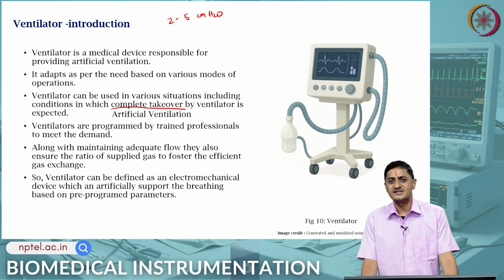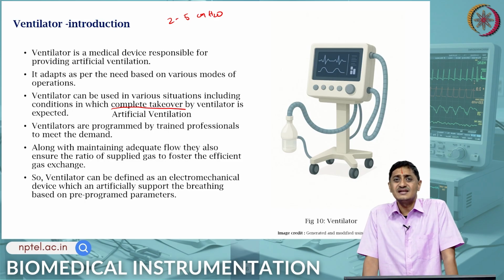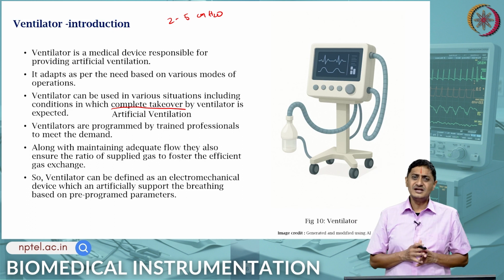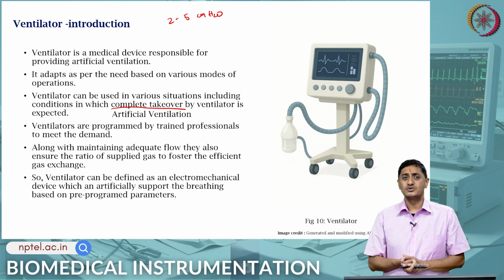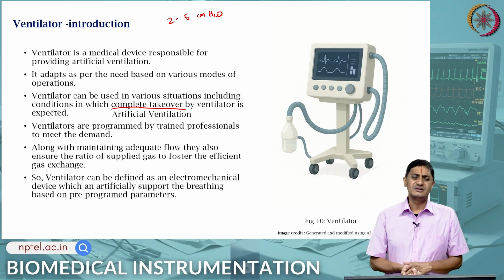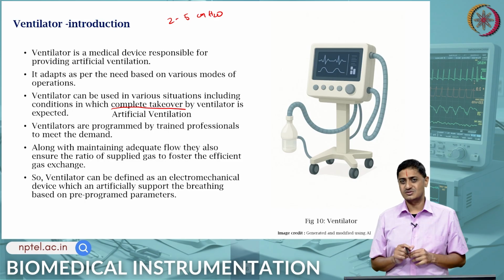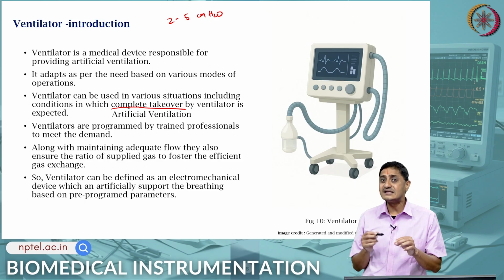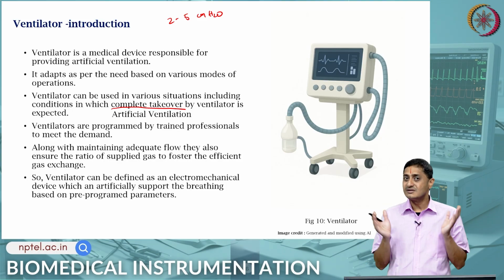Before we proceed to the physics, let us discuss the design and fabrication of a ventilator. Ventilators are programmed by trained professionals, biomedical engineers such as yourselves, who will decide and design appropriate hardware and then program using an appropriate algorithm depending on the situation. So, now there is a need to adapt to the situation. That means that your algorithm should account for and adjust according to the particular situation.